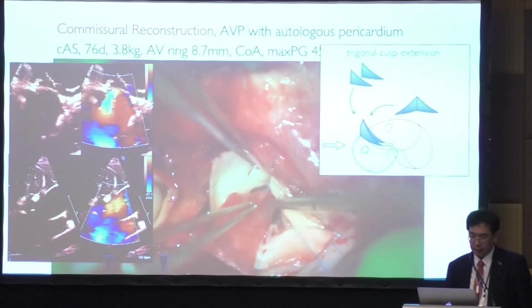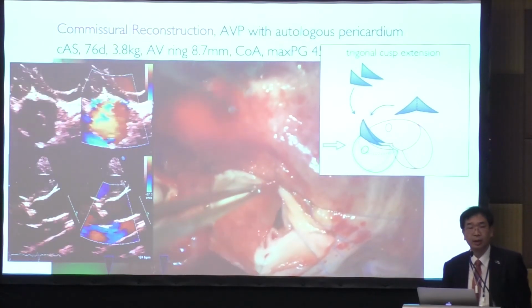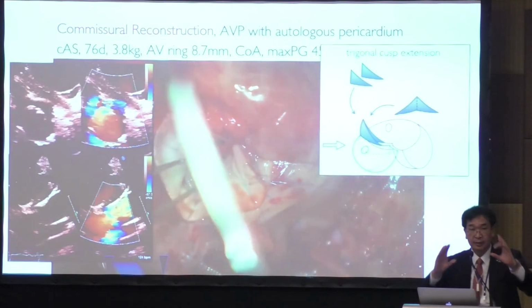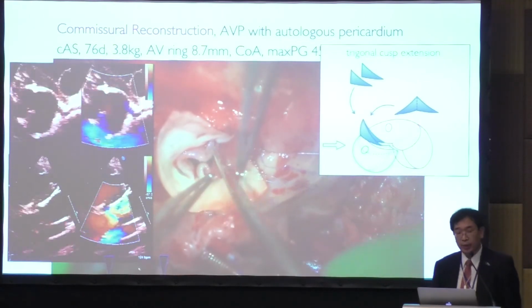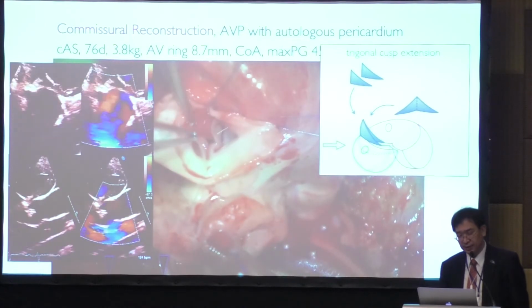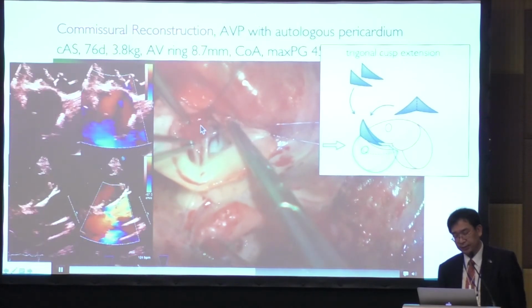Because in making a neonatal aortic valvoplasty, sometimes we have difficulty making an exact, detailed, meticulous stitch because of the size of the ascending aorta opening. So together with this open sleeve technique, we can make a better operative field to perform meticulous and detailed procedures. You can see 8-0 to make a little larger defect.